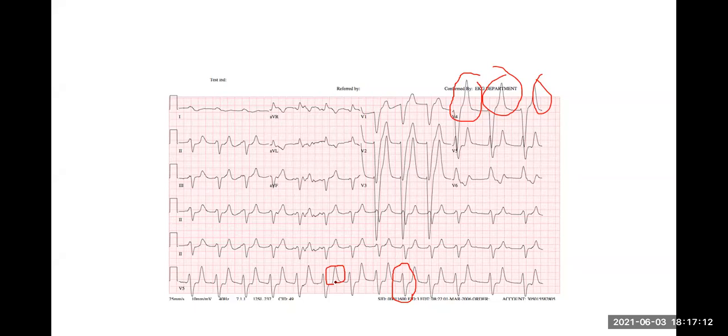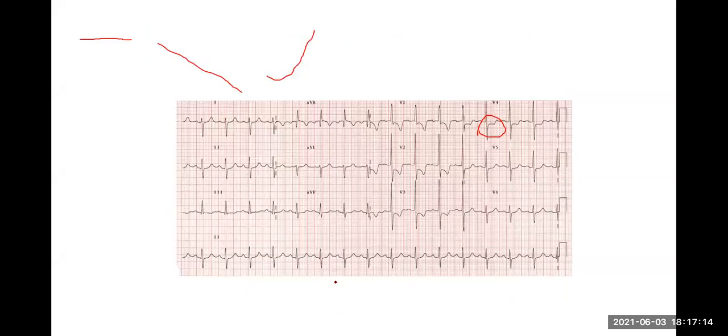Somebody's asked what the J point is. So the J point is a small notch just before the ST segment. That's called a J point. I'll show you a picture later. Remind me.